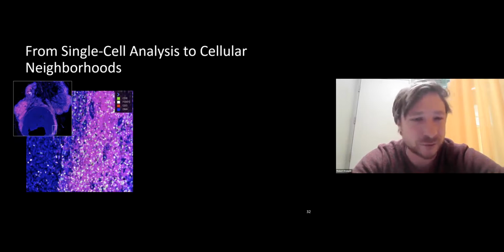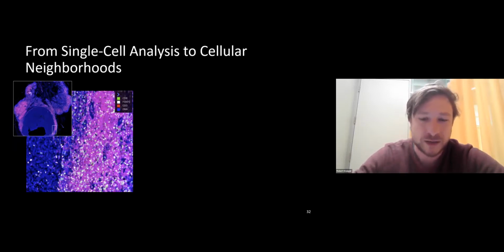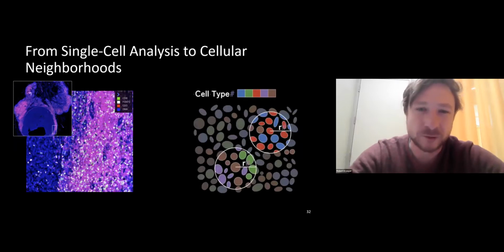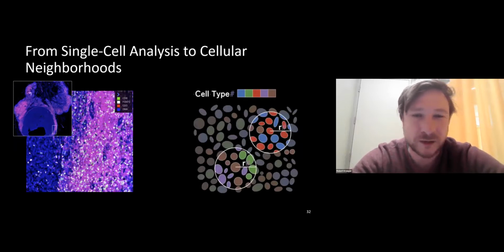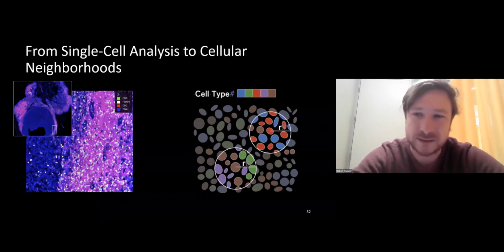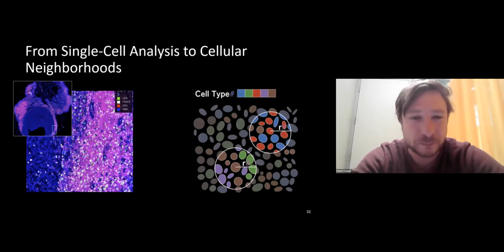So basically, it's really not only about cell typing, but in what surrounding certain cell types appear. And there are, of course, multiple ways to look at that. There are image-based approaches, of course. There are graph-based approaches, drawing on motif discovery and things like that. And we have also looked into these, but we found for our data sets and as a first shot about the whole slide image, we go with a distance-based approach using the extracted tabular data.